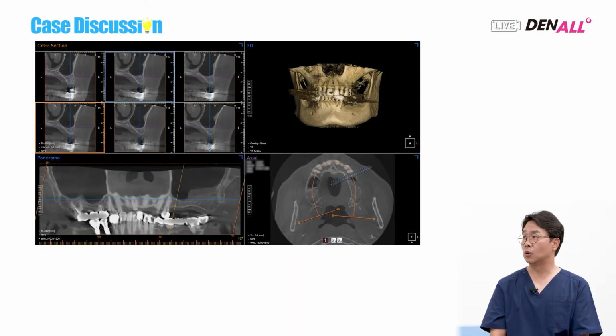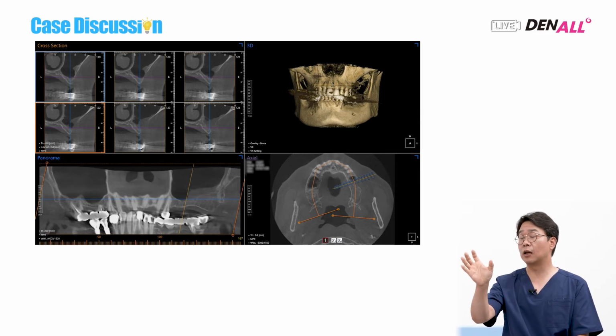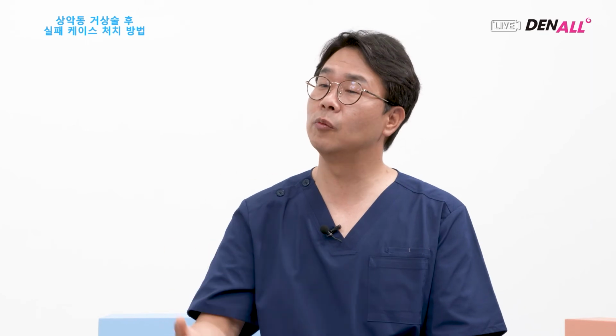Even in such cases, we need to follow the basic principles. We need to have dialogue with the patient after the causes are resolved. There's no graft material here, only a thickness is observed, and there are no sources of infection here. Over time, things will improve. We need to be patient. We need to talk with the patient. We need to lead the patient. After resolving all the causes of pain, sometimes we need to wait.